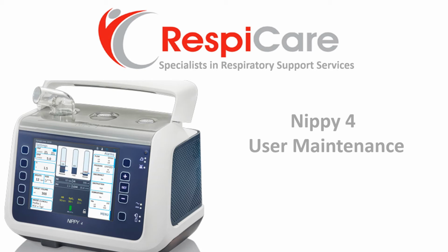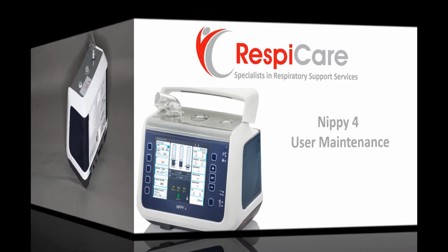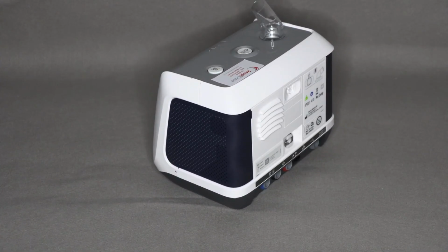Our staff at Respicare will call to check your Nippy 4 ventilator and mask periodically, and we are always available to support you at your request. But there is some minor maintenance that you'll need to do on your own or have done by a carer. Each month you will need to clean and change some of the filters in the ventilator.